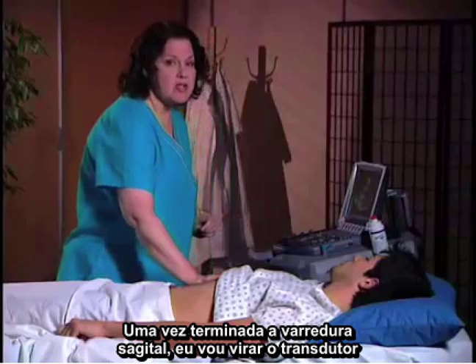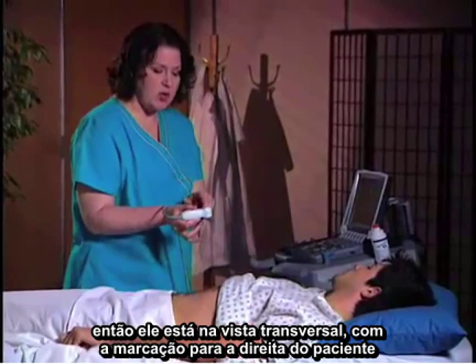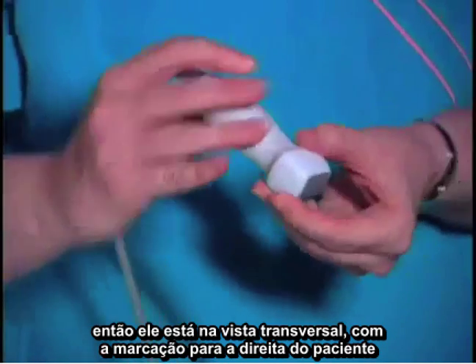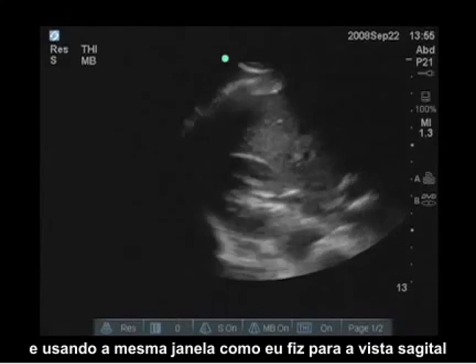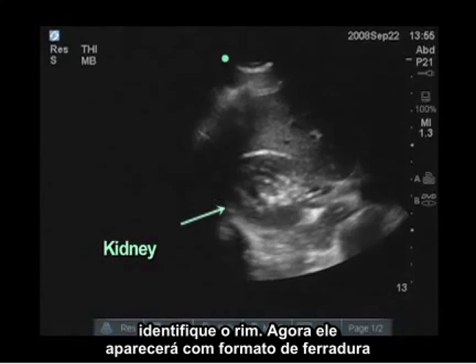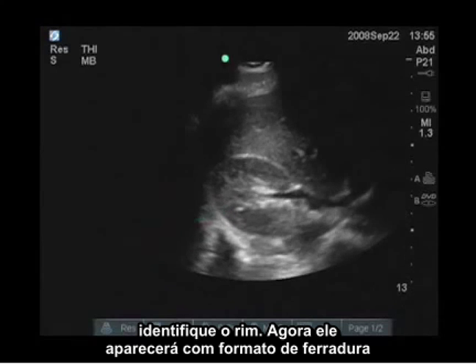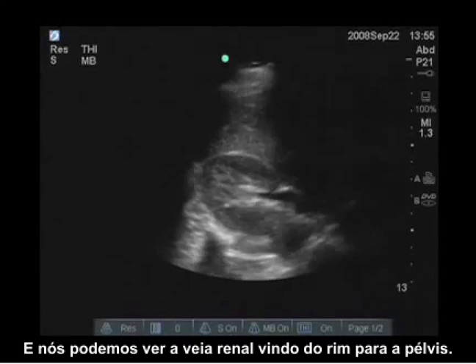Once I've finished the sagittal sweep, I'm going to turn the transducer so it's in a transverse view with the marker to the patient's right. Using the same window as I did for the sagittal view, identify the kidney. It will now appear as a horseshoe shape, and we can see the renal vein coming into the pelvis of the kidney.